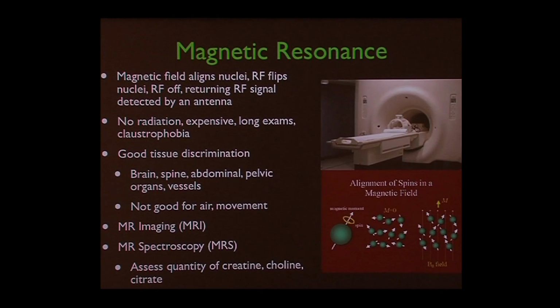And then with various complex methods, we can figure out where the signal was coming from all through the patient's body and all sorts of other information. And we can manipulate how we gather the data by changing the radio frequency, changing how long we wait to listen for that signal that's coming back, all sorts of things. All done without any moving parts and without any radiation. But they have to go into a tube.